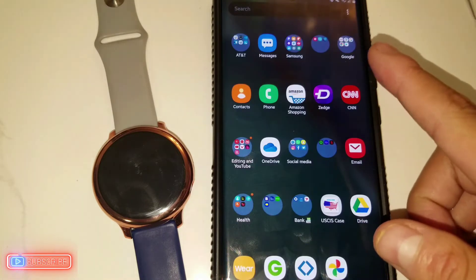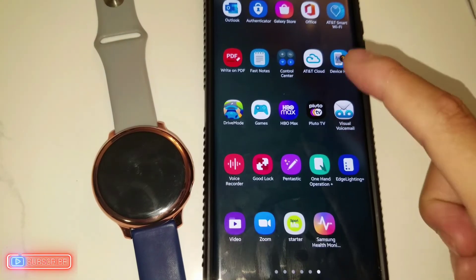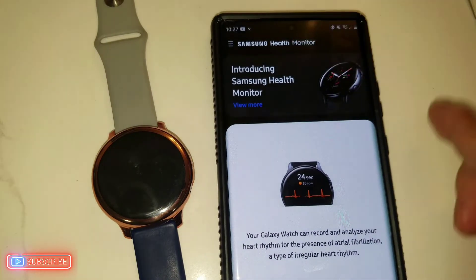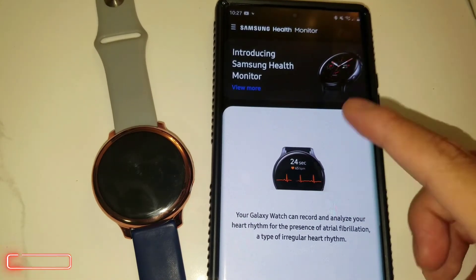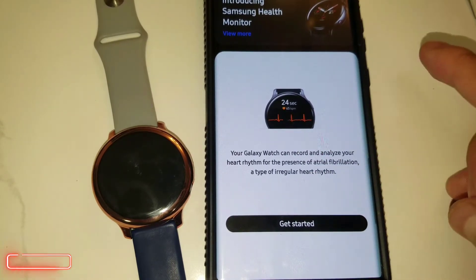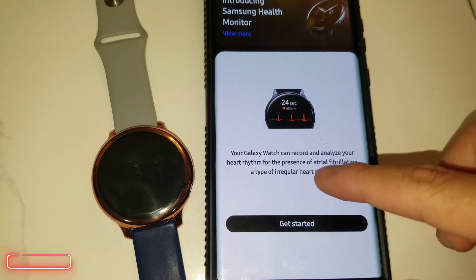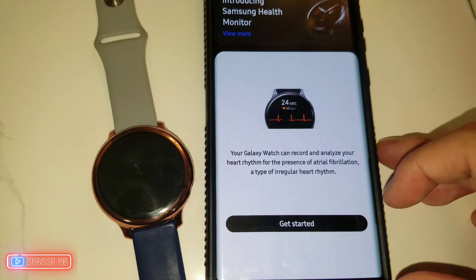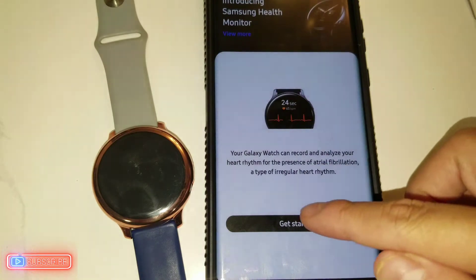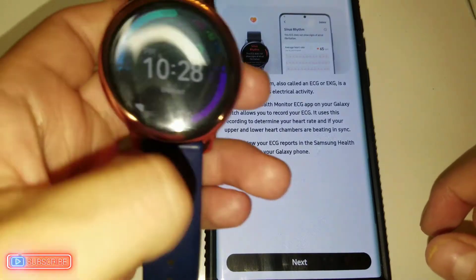After the update has been completed, you will see a brand new app called Samsung Health Monitor. When you open it, it introduces the app and gives you a message which says: your Galaxy Watch can record and analyze your heart rhythm for the presence of atrial fibrillation, a type of irregular heart rhythm.